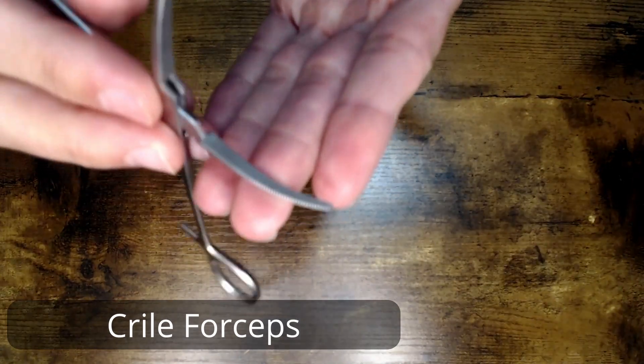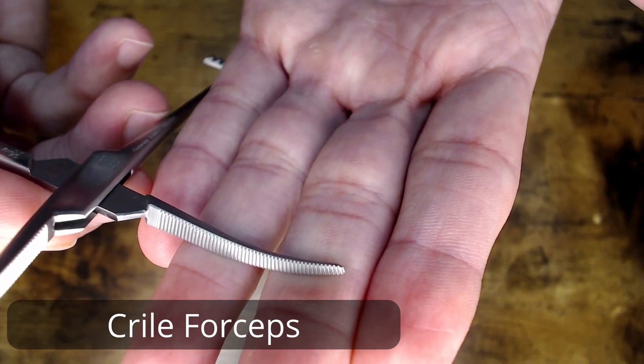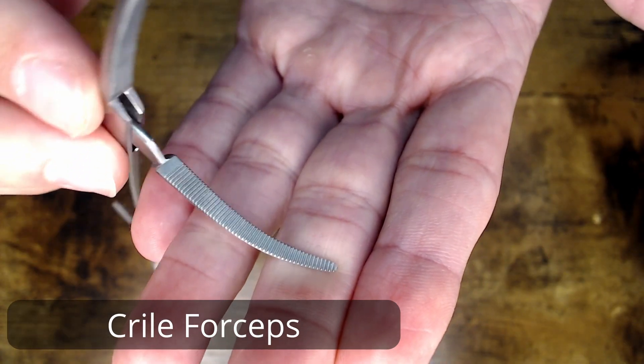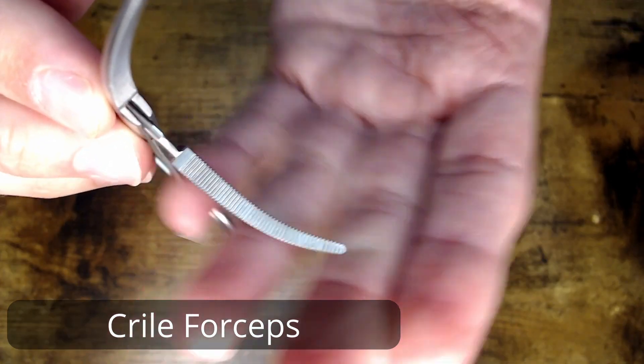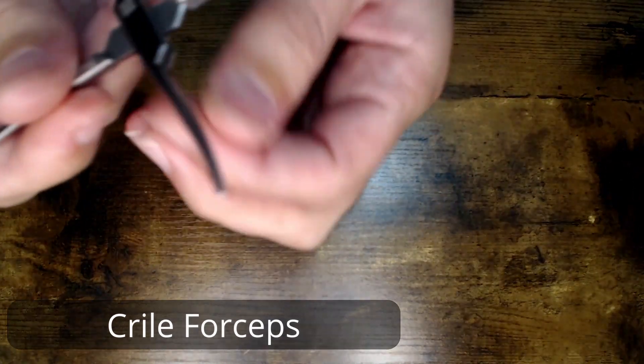Just the normal serration patterns — let's see if we can get you a good look on that. Any time you have serrations, you're going to want to keep a special look out to make sure that they are clean, all the way from the tip to the box lock on both sides.